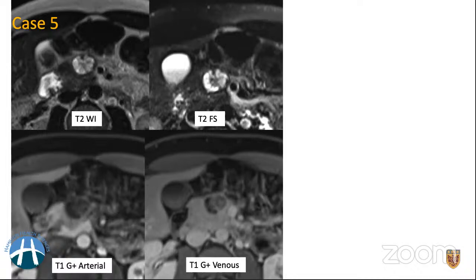Okay, so I've started to see a few here: serous cystadenoma, okay, mucinous. So yeah, basically that's what we were thinking, and this was reviewed at a multidisciplinary hepatobiliary rounds, which we host every Thursday, because even they were not sure what is happening and why this patient has this particular lesion.